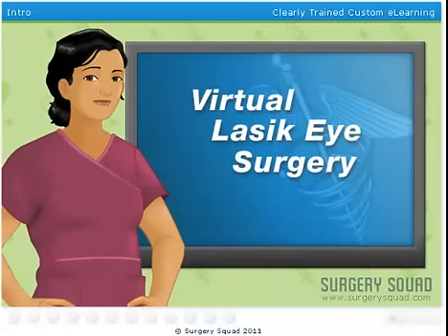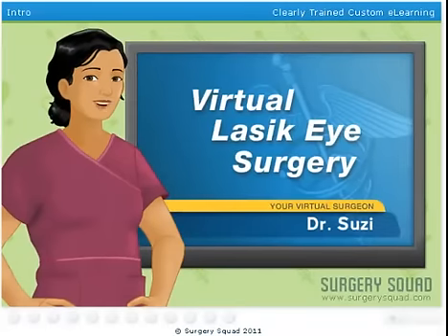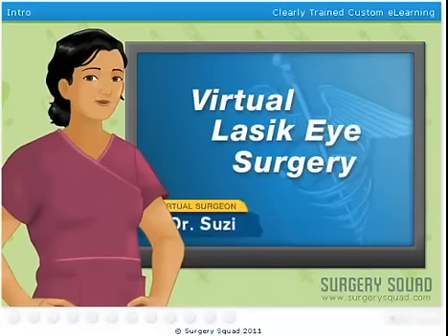Welcome to Surgery Squad's Virtual LASIK Eye Surgery. I am Dr. Susie, and I'll be guiding you through a LASIK eye procedure today.